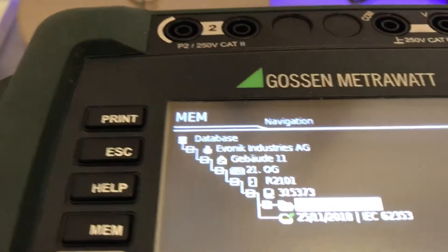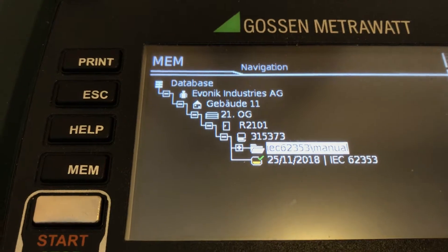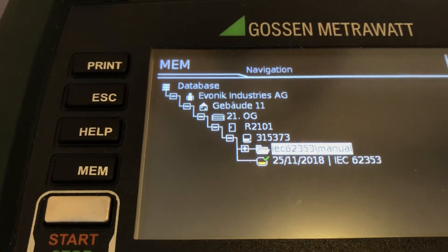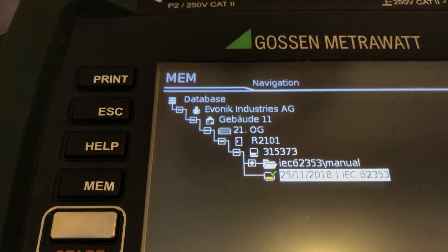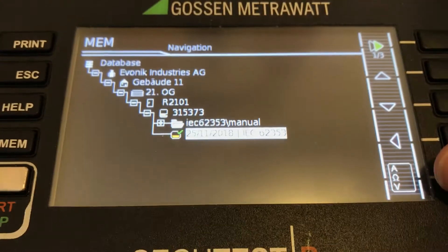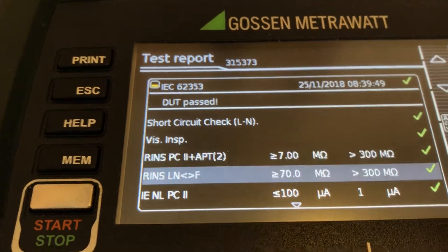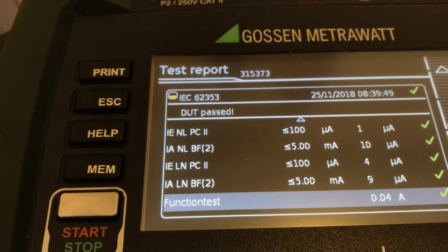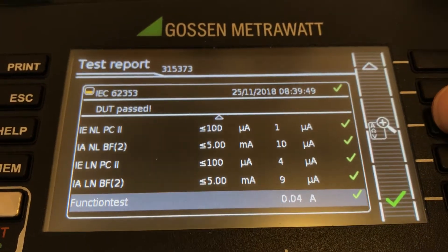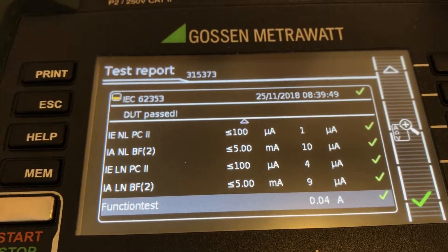We have a wider range of measurement options where we can store single measurements as well as completely auto measurements. We can view the data up here — pressing that shows all the data, and we can see the device's information in more detail, pressing to zoom in or zoom out.